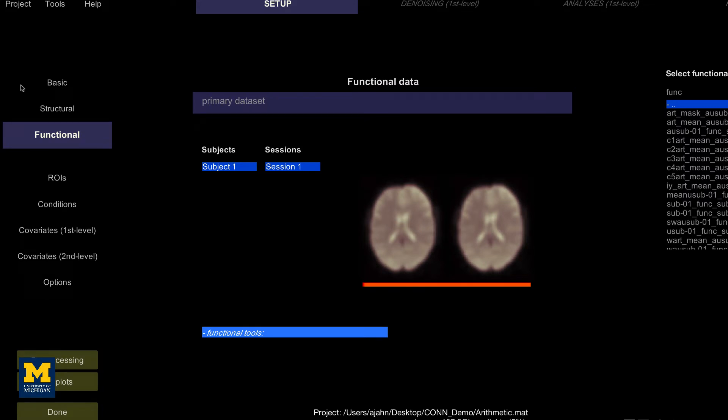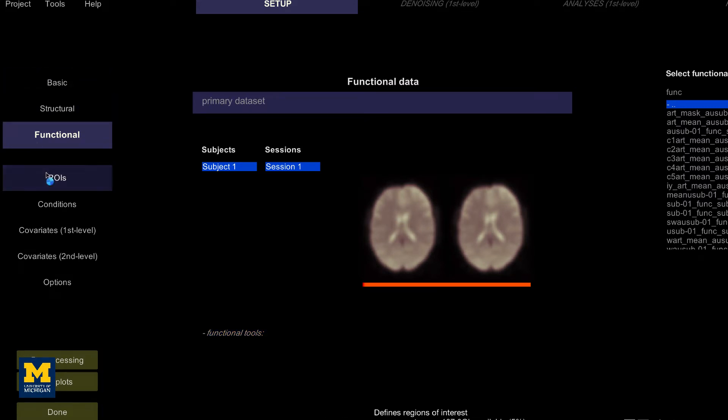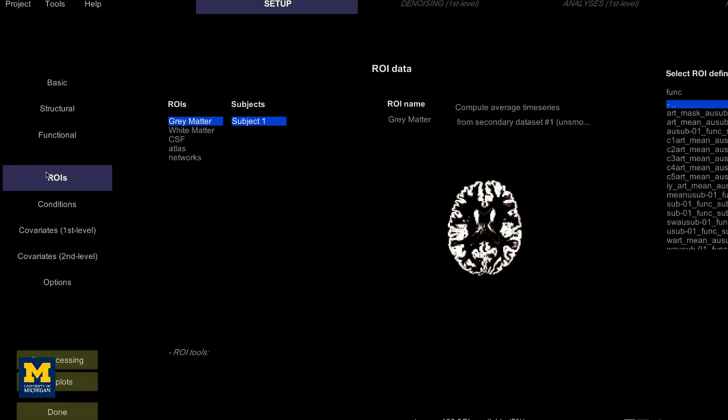We now come to the regions of interest tab, which lists the different regions that will be used in the connectivity analysis. Five sets of ROIs have already been generated for you: gray matter, white matter, cerebral spinal fluid, atlas, and networks.